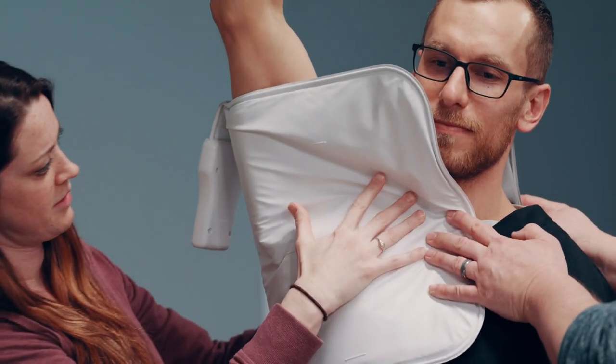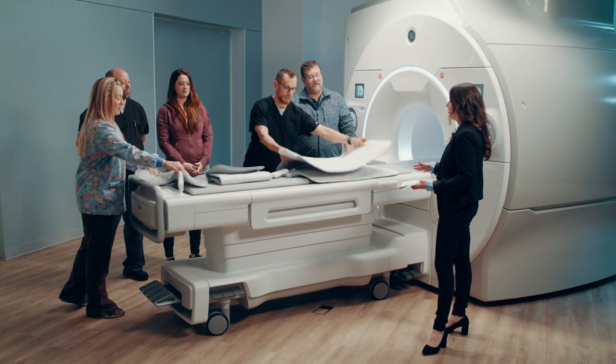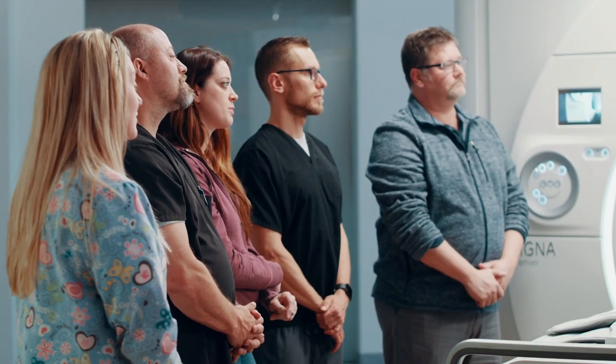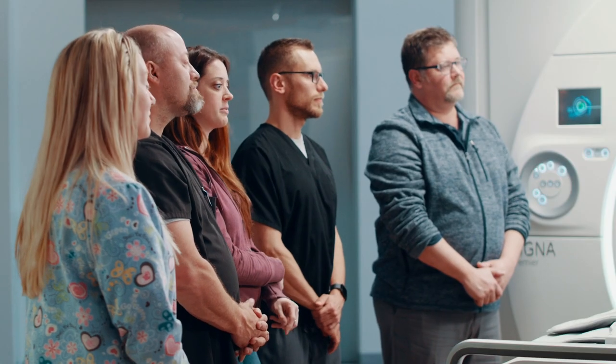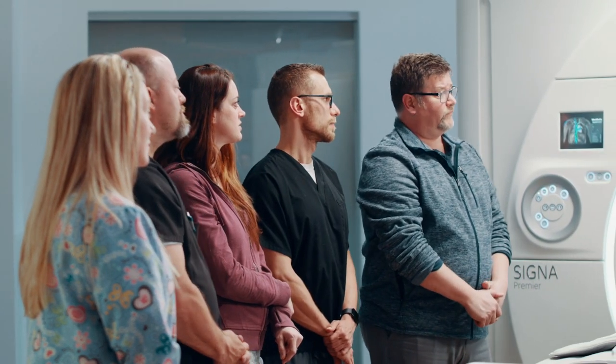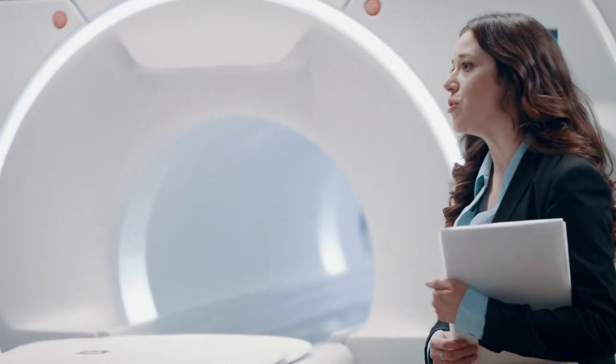Flexibility — the old coil was 145 grams per channel. GE has reduced that to 35 grams per channel. That's really good. Who wants to take a guess at how many channels are in the coil? 20? 30. With the conventional coils, what is the normal field of view coverage? Up to 58 centimeters. This Air Technology coil has a field of view coverage of 65 centimeters. You get a whole femur on there with no coil cut off at the top or the bottom.